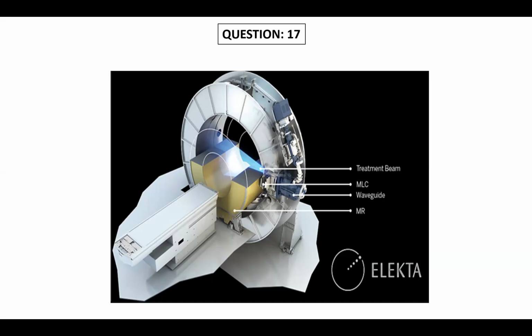And it has this adaptive radiotherapy also, sir. Yeah, online adaptive. Yes, you have to do the online. Without adaptation, you cannot do it. You have to do an adaptive plan. If there are not many changes, you can go ahead with the old plan. But anyway, you have to do the adaptive.